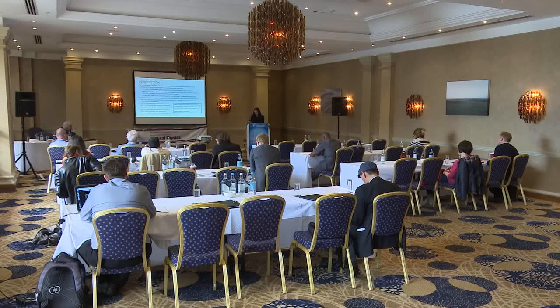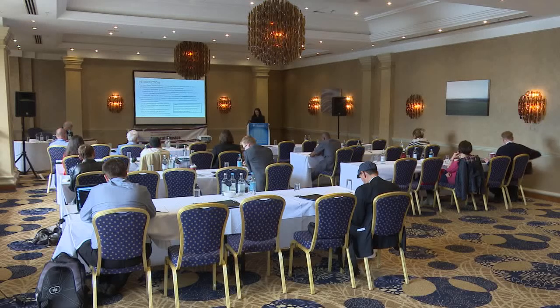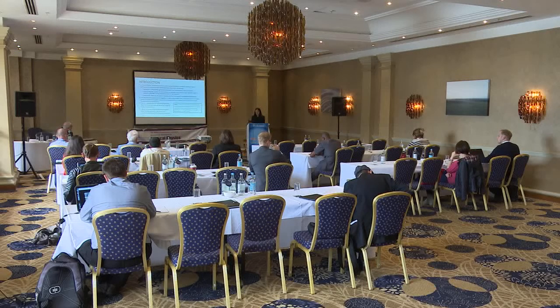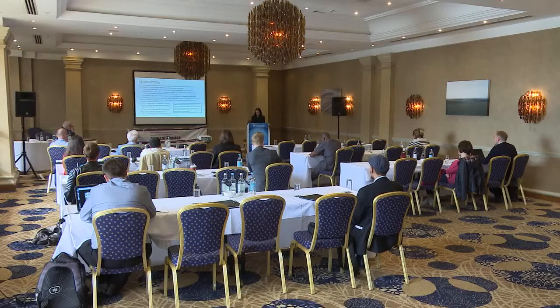Diagnostic reference levels are defined as dose levels in medical or interventional radiologic practice for typical examination for groups of standard-sized patients or standard phantoms for broadly defined types of equipment. The DRLs are not applied to individual patients, but are used for a given medical imaging task or protocol. Basically, the objective of DRLs is to help avoid excessive radiation dose to the patient that does not commensurate with the clinical purpose.